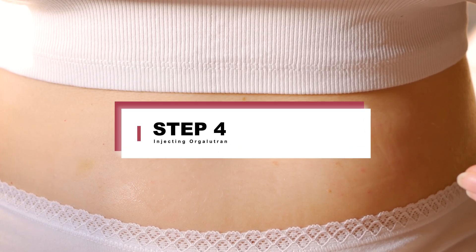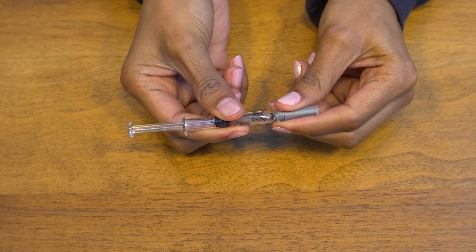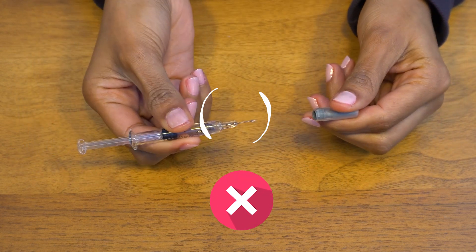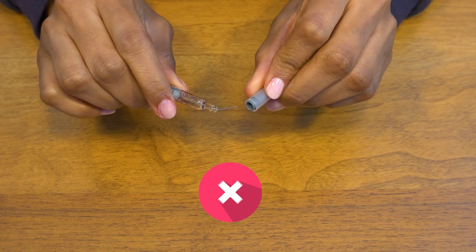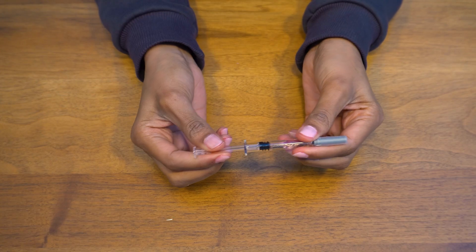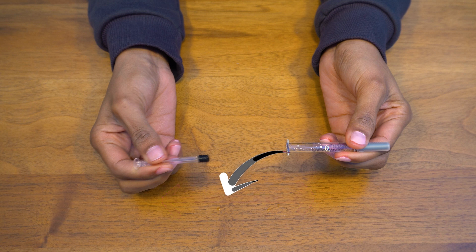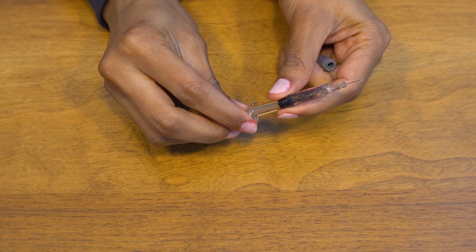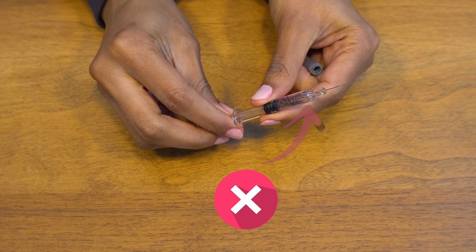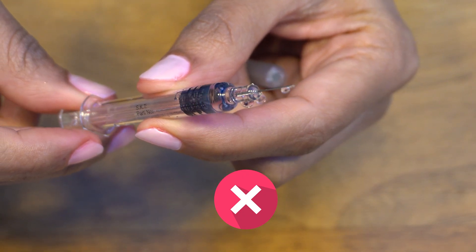Step 4: Injecting Orgolutran. Remove the needle cap from the pre-filled syringe without touching the needle. Don't bend the needle, otherwise you may break it. Don't hold the syringe by the plunger area, as it may cause you to spill all the medication. Do not try to expel the air inside the syringe — a small amount of air is not detrimental, and you may waste the medicine while trying to remove a tiny air bubble.